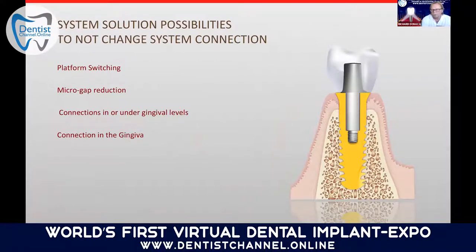There are, of course, things that one can do with a non-conical connection. You can, of course, design platform switching. You can try to reduce the micro gap by producing the connection with a tighter tolerance. You can make the connections in or under gingival levels, or you can make the connection in the gingival level itself.